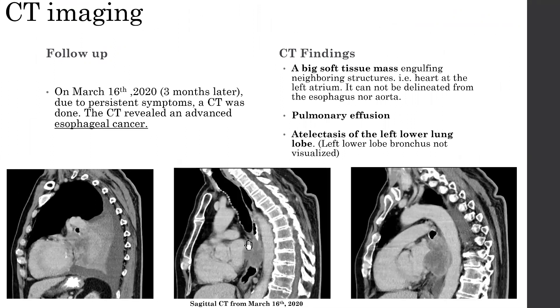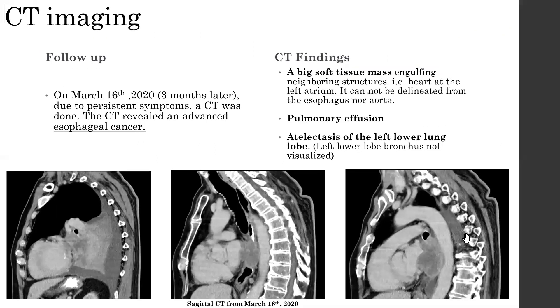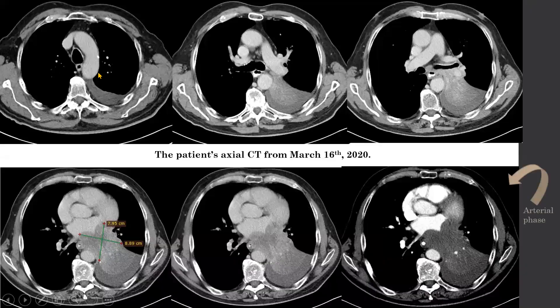The mass can be seen in relation to neighboring structures such as the aorta, the esophagus — which has contrast — and the trachea, as well as the heart. On axial CT slices, you can see the trachea, esophagus, and aorta, as well as the darkened density of pleural effusion.